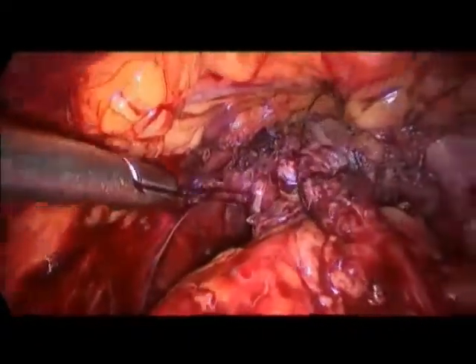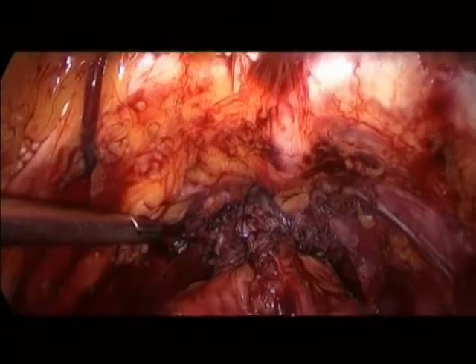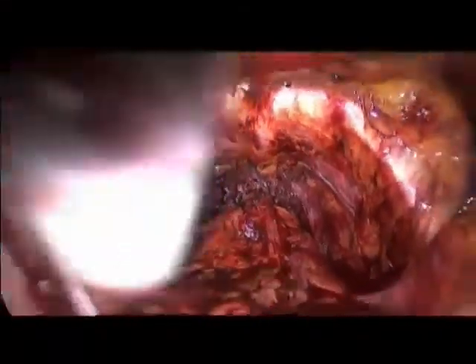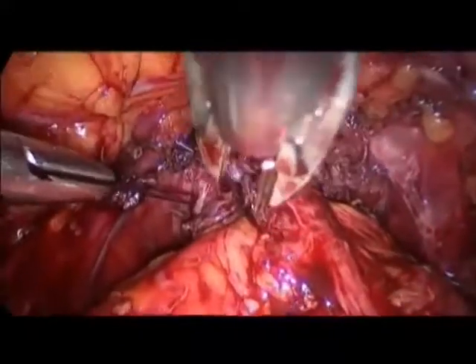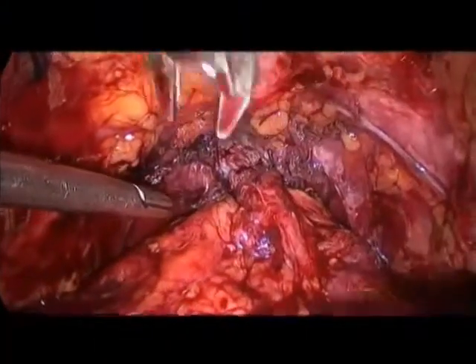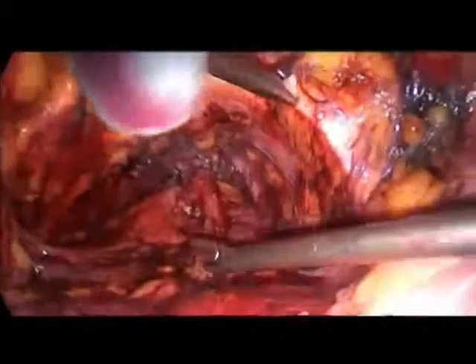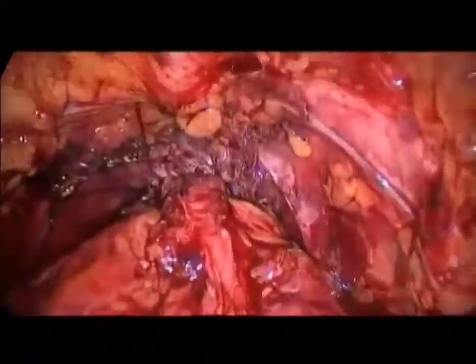So the Rocco, yes. Well, we will solve that. Give me a 5 millimeter clip. Clips. Yeah, yeah. This is nothing. There is no clip. Again, no clips. Oh, the clip is ready. Okay, we will now change the catheter and test the anastomosis.